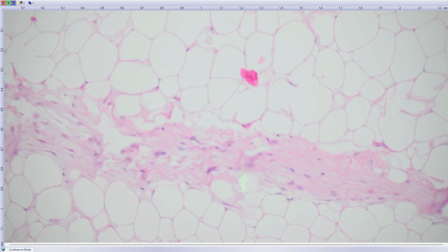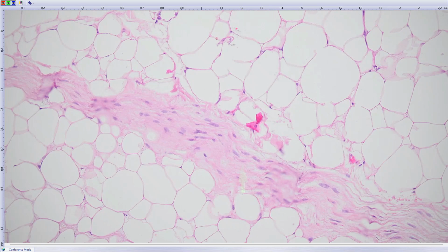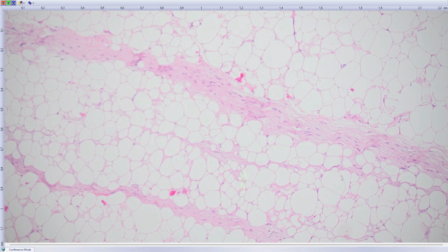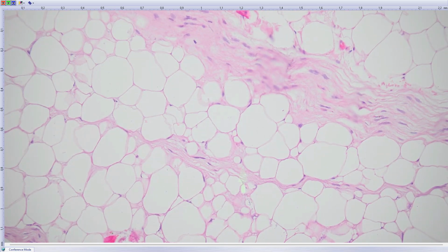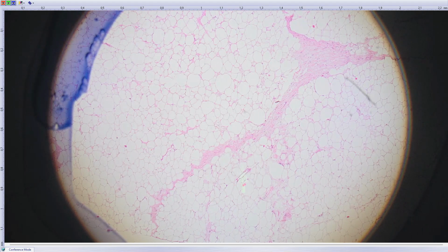on hematoxylin and eosin stain. Again, the septae in this area are also plump, with hyperchromatic spindle cells. These cells would basically shine with MDM2. Here in the middle, in this area, you can see nice lipoblasts, but they are absolutely not necessary for diagnosis. This is another block from the same patient.